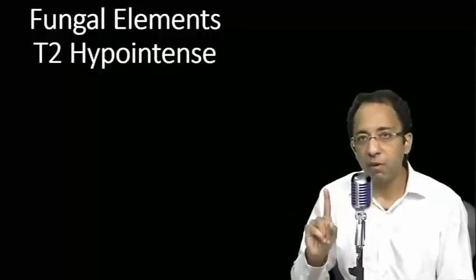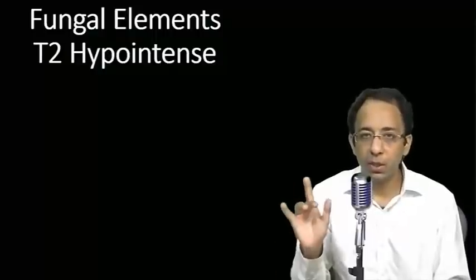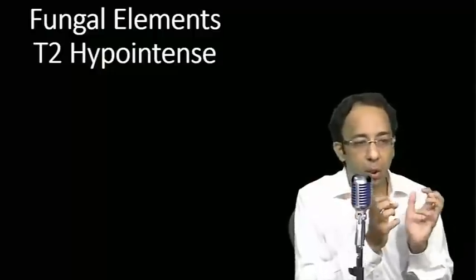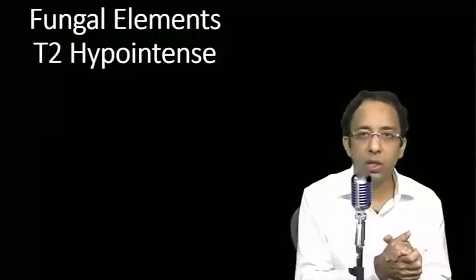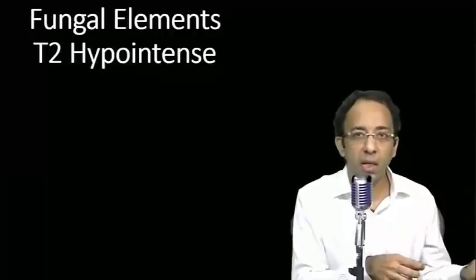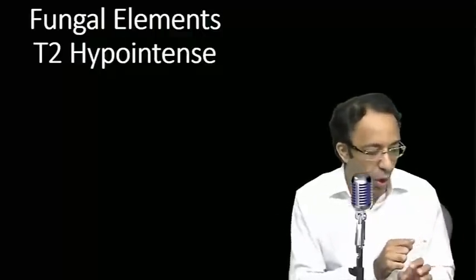But remember, in fungal infections, the fungal elements lead to a T2 hypointense appearance. That means in sinusitis the sinus will be bright, white on a T2 weighted image because of fluid. Here, because of fungal elements, you will find dark areas. So fungal elements will lead to hypointense signal on T2 weighted image.